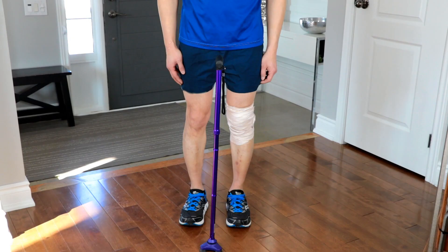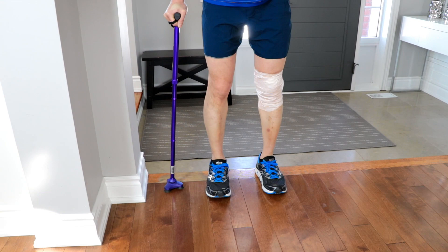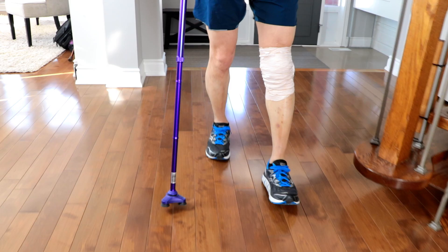The cane is used in the opposite arm of the injured limb, ensuring a wide base of support for better balance. The goal is to have a normal walking pattern with the cane and injured limb always moving together.